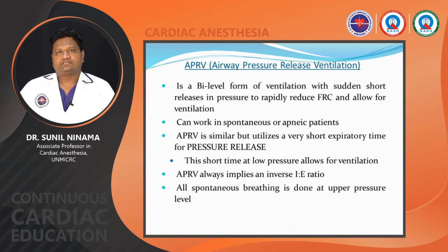Airway pressure release ventilation, APRV mode. This APRV mode is a bilevel form of ventilation with a sudden short release in pressure to rapidly reduce the FRC, functional residual capacity, and allow for ventilation. It can work in spontaneous or apneic patients. APRV utilizes a very short expiratory time for a pressure release, and the short time at low pressure allows for ventilation. APRV always implies an inverse ratio, I ratio, and all spontaneous breathing is done at the upper pressure level.